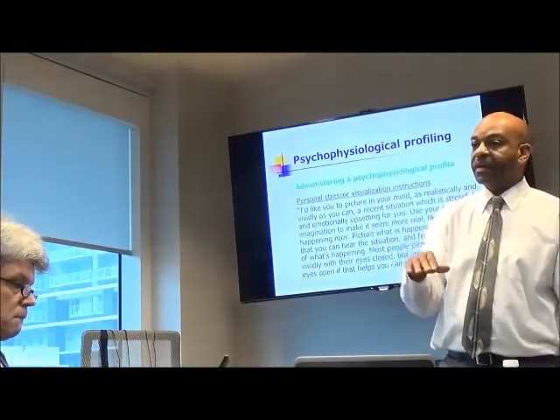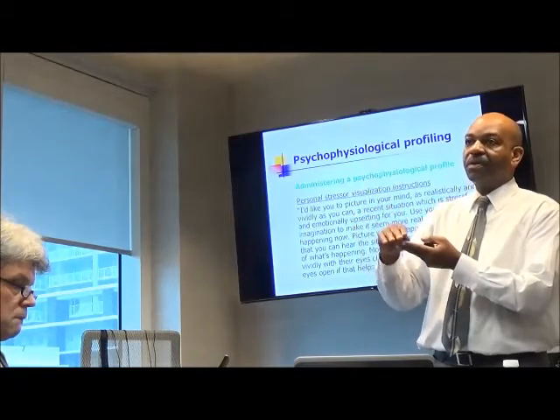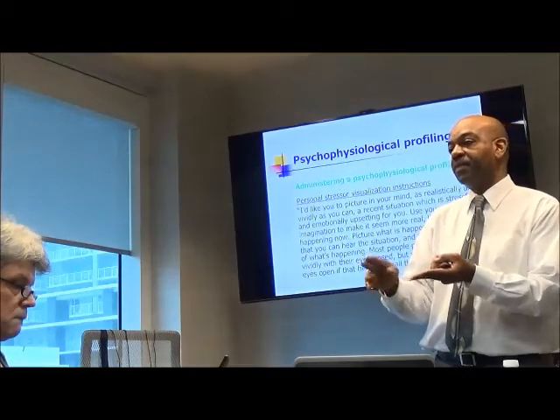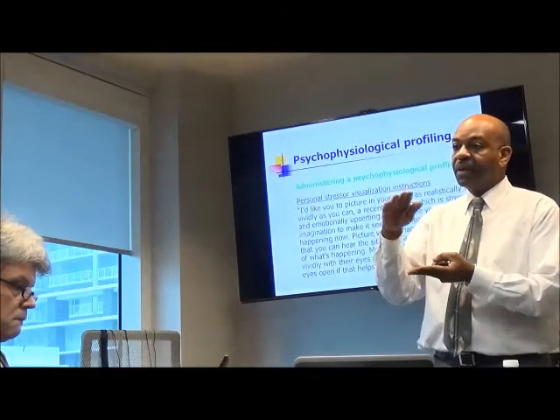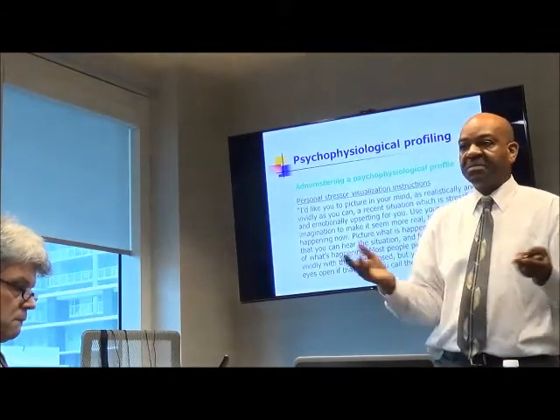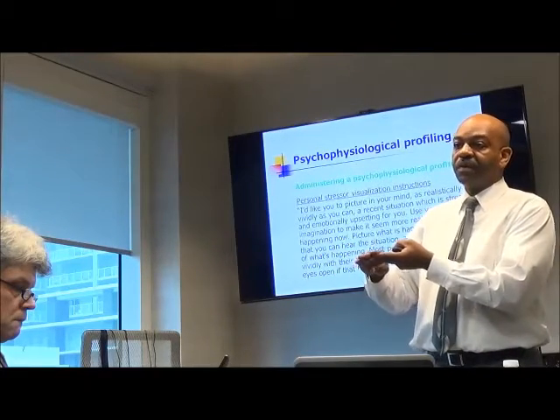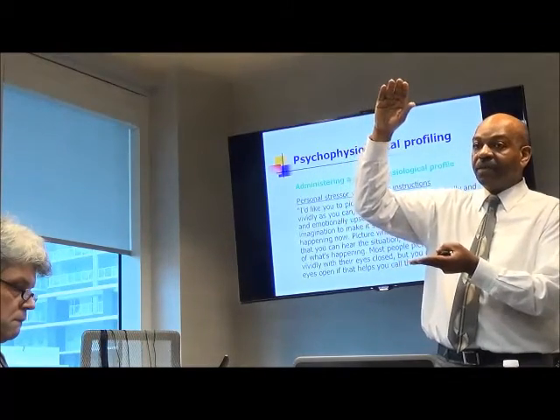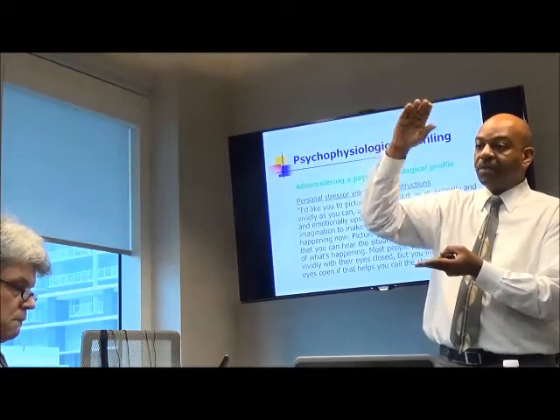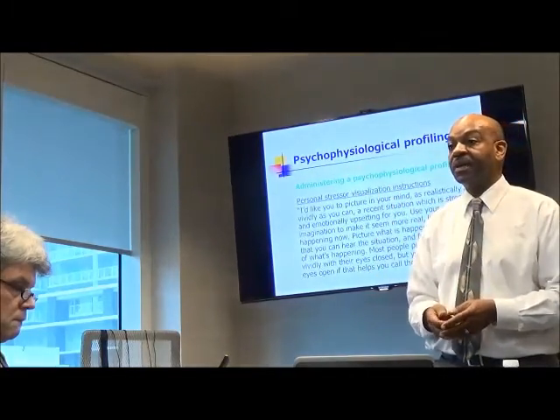Now, if it comes back, first of all, how much it goes up is important. So if they go from, let's say for EMG, from 2 microvolts to 4 or 5 microvolts, and then they go back to 2 microvolts, that's no big deal. But now if it goes from 2 microvolts to 25 microvolts, and then when they stop talking about it, it only comes down to 20, that's important. That's something to work on.